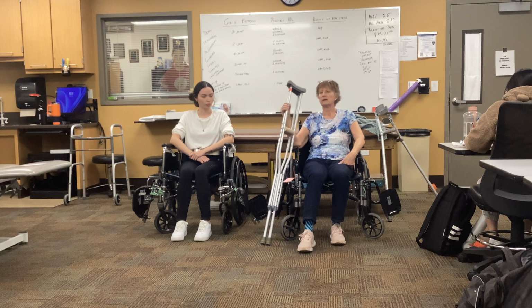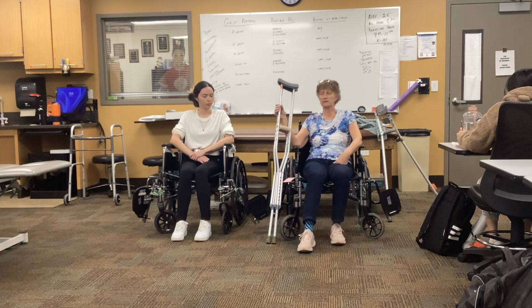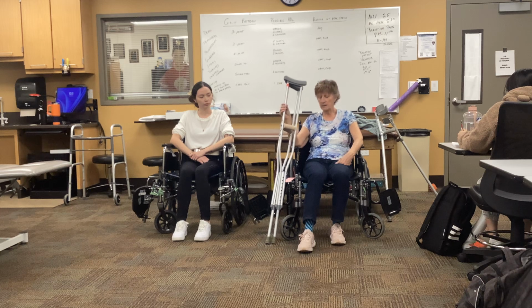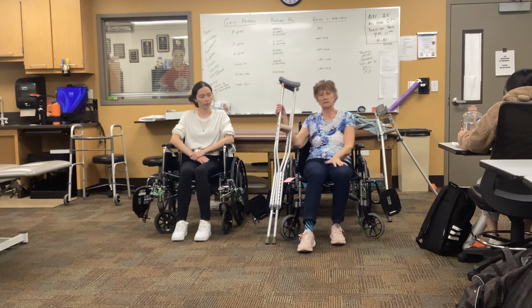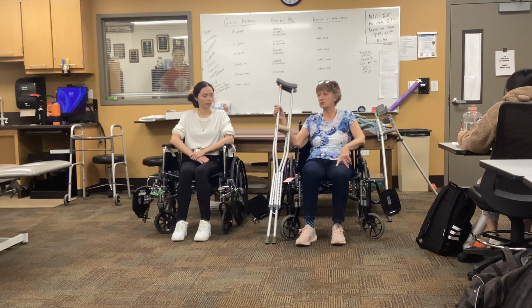Okay. All right. And whether the patient has to lock them before they stand, or there are some with drop locks, so as soon as they stand, the lock falls into place, depends on the type of brace they have. Okay. All right, so we are still going to stand up the same way. Since both lower extremities are involved, my right side is my stronger side, and I've already asked Amanda, and she said her right side is her stronger side.